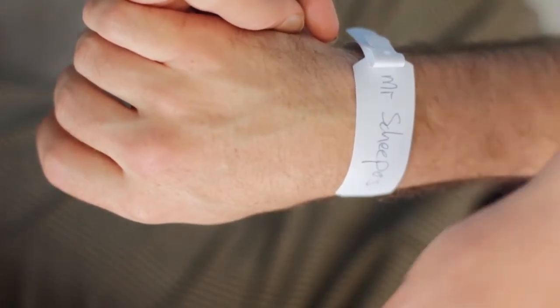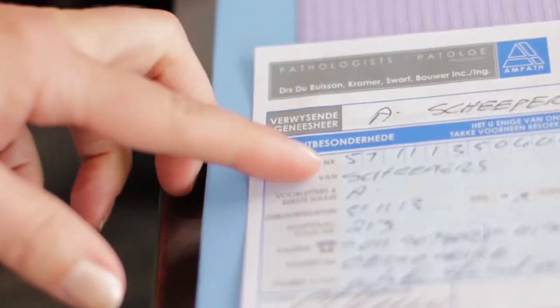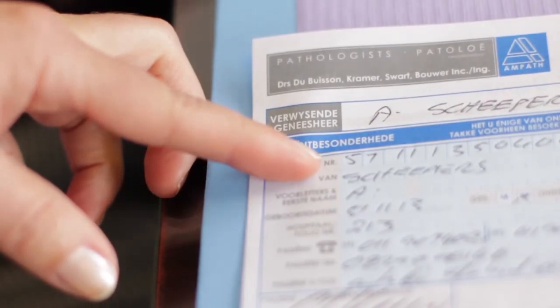Before starting this phlebotomy procedure, first greet the patient and introduce yourself. Pause to confirm that you have positively identified the correct patient and that you are performing the correct procedure.